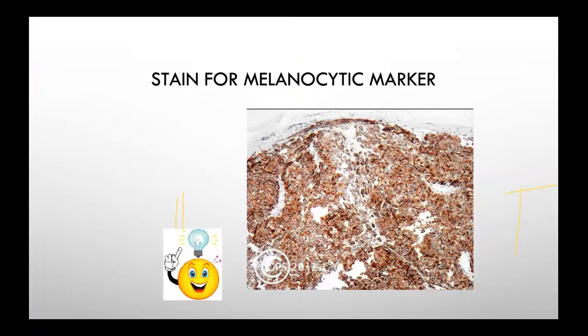So, anybody know what is the stain that we are using for a melanocytic marker? We are using one of the stains for our lesion here. Anybody can type which stain you usually use for a melanocytic marker? S100. Yes, S100 is one of them. Any other stain? Yes, HMB45, the one that we are using here for our lesion. Any other one? Tyrosinase and MITF as well. Okay, so that's a couple of different stains.